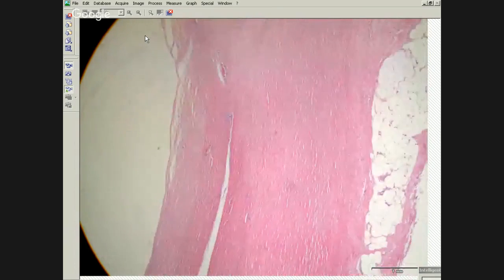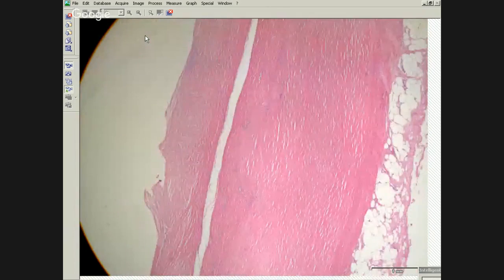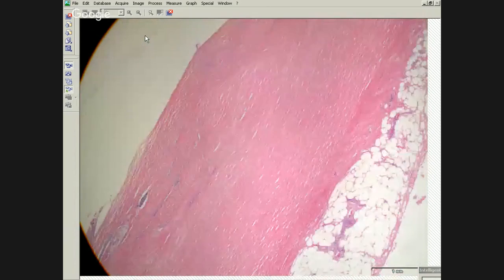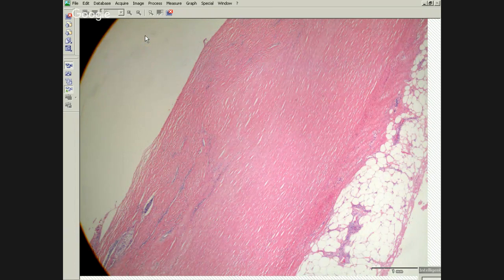So do you also start thinking of SFT when you see fibrosis? Yes, SFT, particularly if you don't have a good clinical history, and I apologize to any clinicians in the audience, sometimes clinicians can be very poor historians, which is another reason you really want to check the radiology and the distribution. So solitary fibrous tumor is going to be a localized mass.